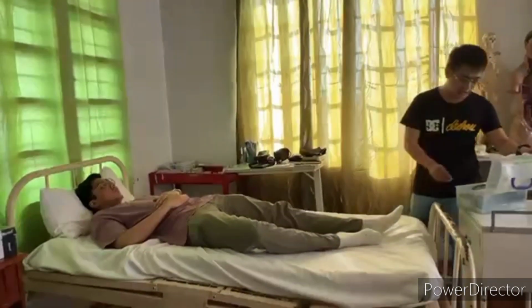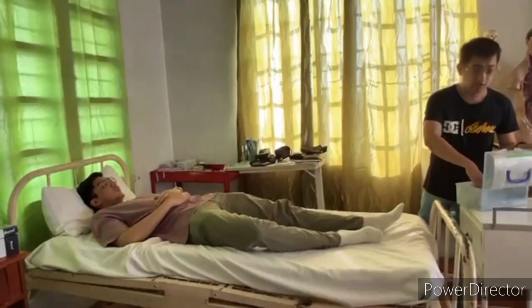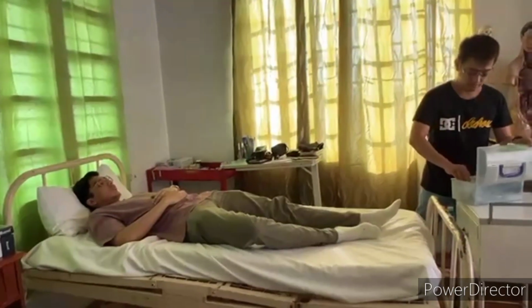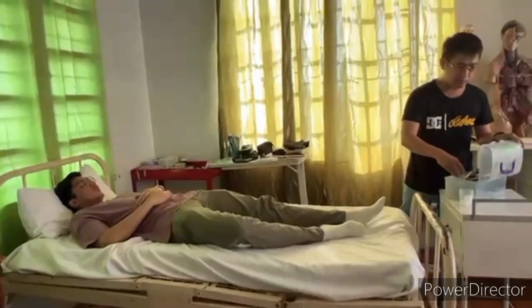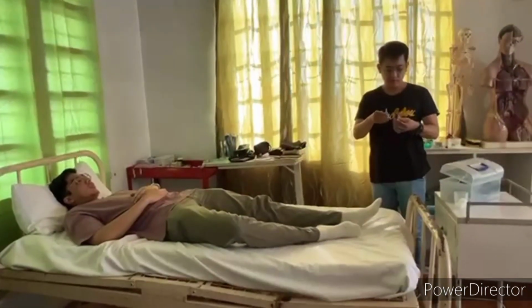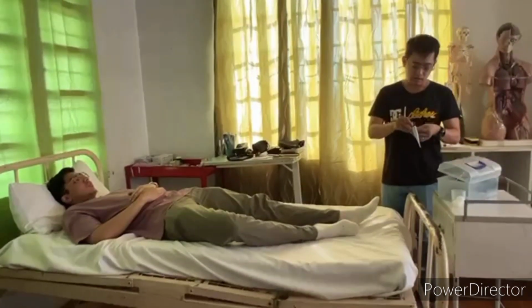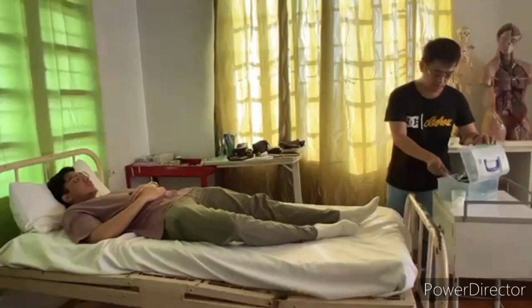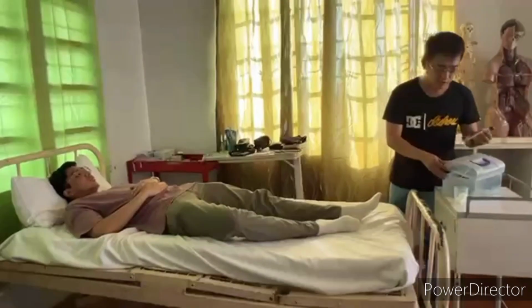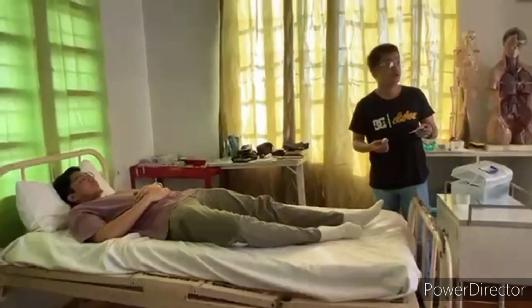So we're going to be starting in getting the temperature of the patient. In getting the temperature, we're going to be using the thermometer. So we have to get the thermometer from the receptacle. Okay? And then, before using the thermometer, we have to clean it first using our cotton ball soaked in alcohol.